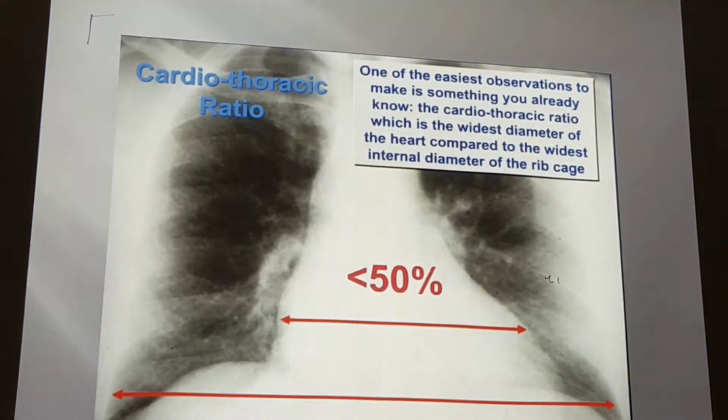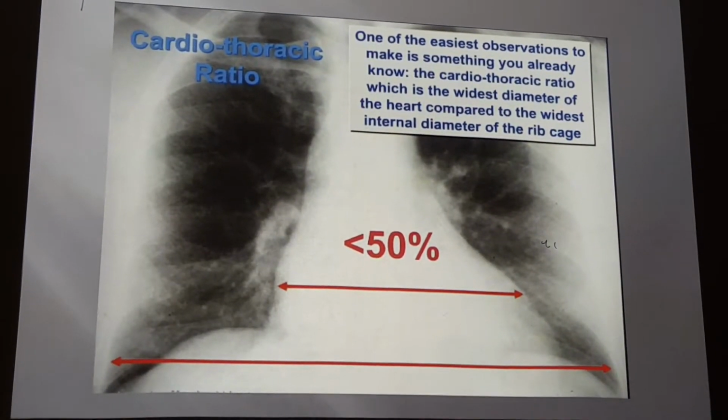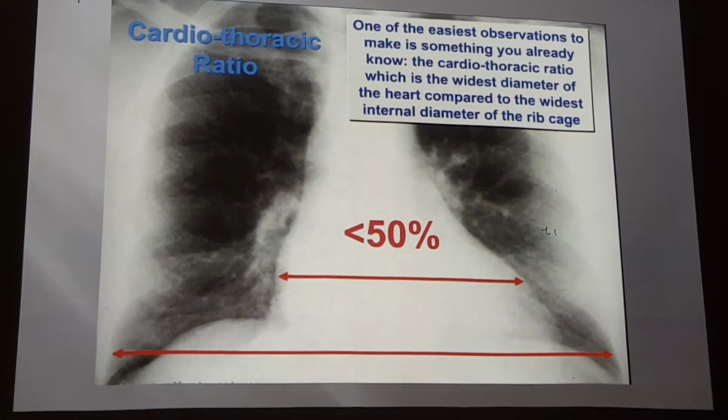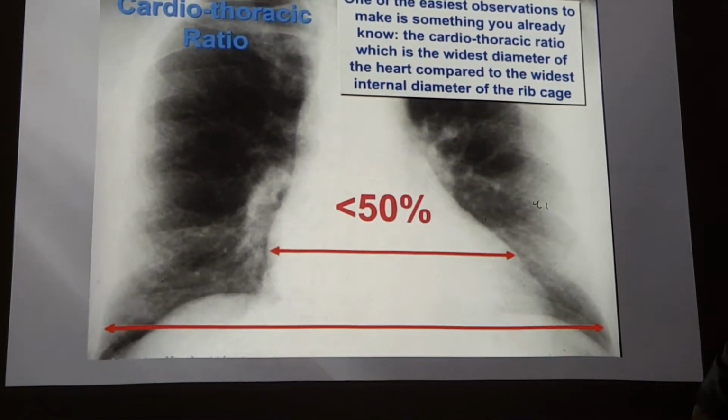Diba? So yung cardiothoracic ratio, sinabi ni Dr. Cabano, lecture ba? Ha? Hindi yata. Hindi niya sinabi kung ano yung cardiothoracic ratio? Sino yung mga tulog, agising noon?